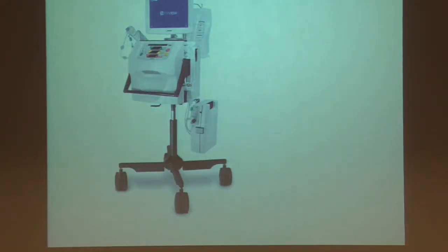So the next machine, I used to use this in some of the hospitals I worked at. It's fairly simple, I guess. You have 3 modes that you set, and the reason I want to bring this up is you set your blood flow rate, how much fluid you want to take off, and then there's something called a therapy fluid rate. So later I'll talk about dose of dialysis.